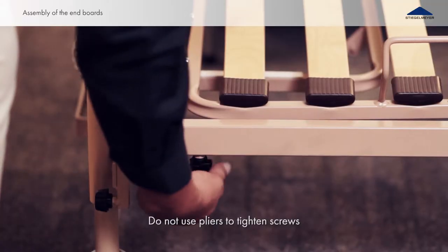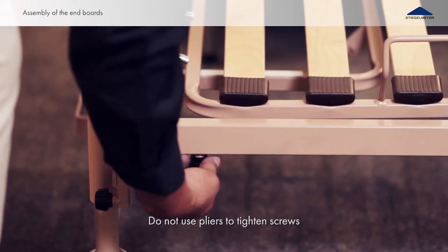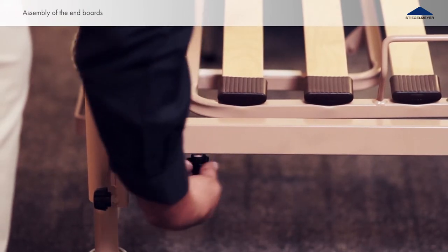Tighten the four knurled screws. Repeat this process at the foot section end board as well.